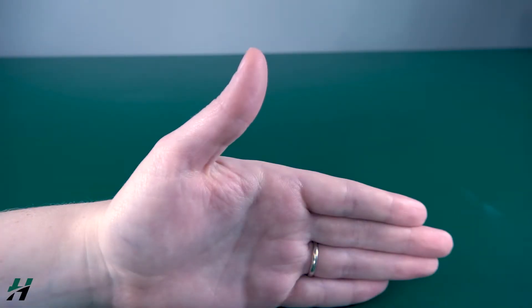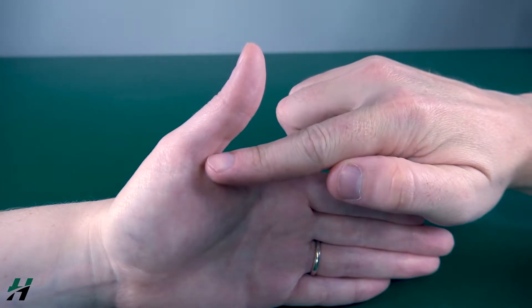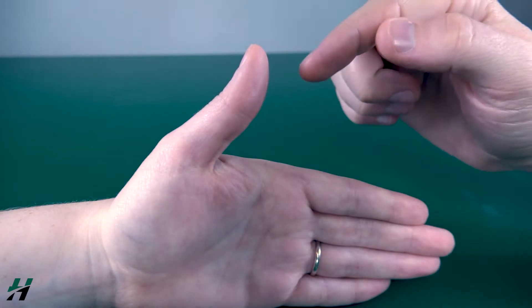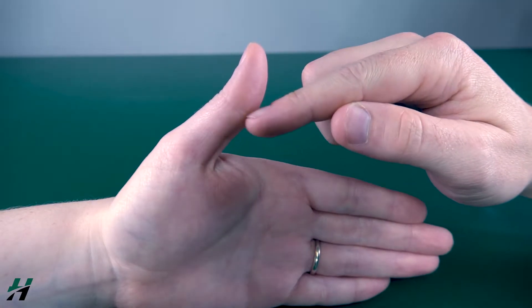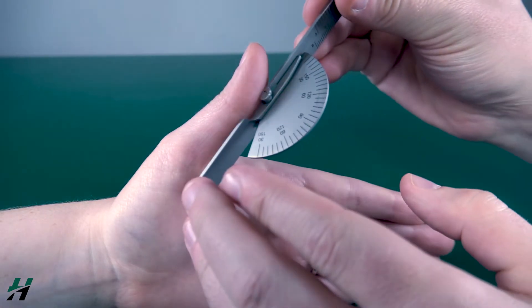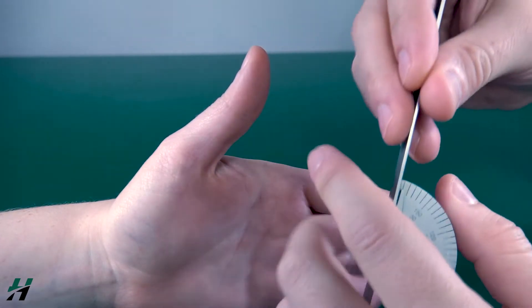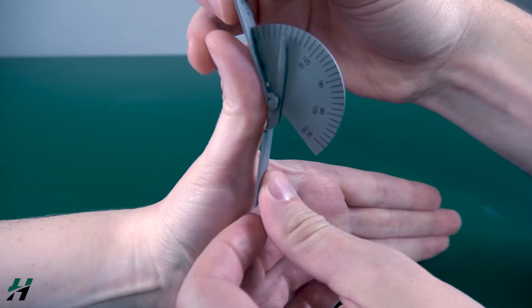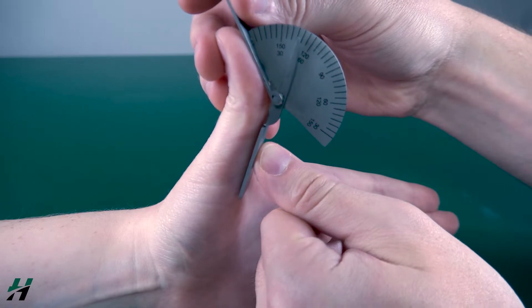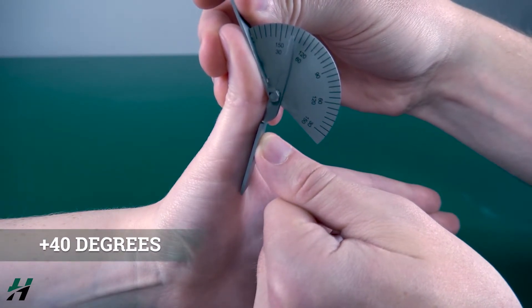Measuring thumb IP hyperextension. You want to have your stationary arm on the proximal phalanx, your movement arm on the distal phalanx, and your axis on the IP joint itself. Rachel, hyperextend that thumb backwards as far as you can go. We're looking at 40 degrees of hyperextension.